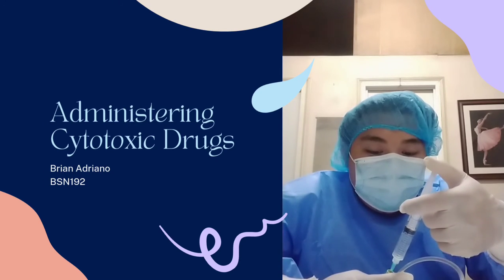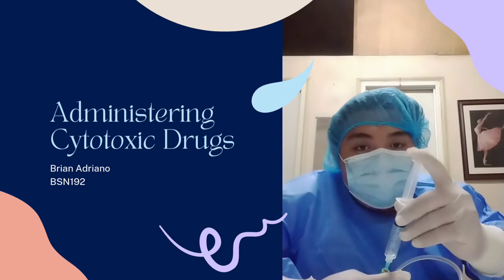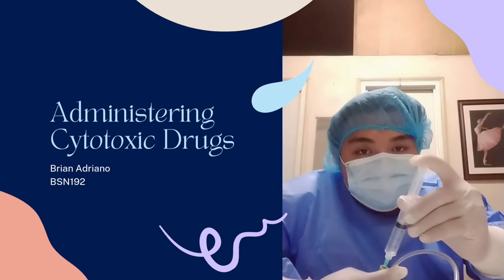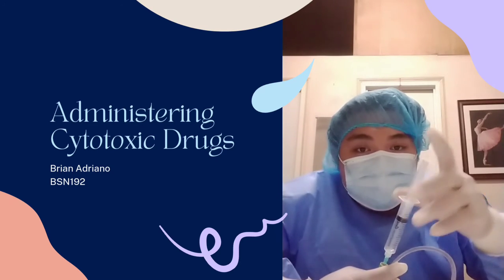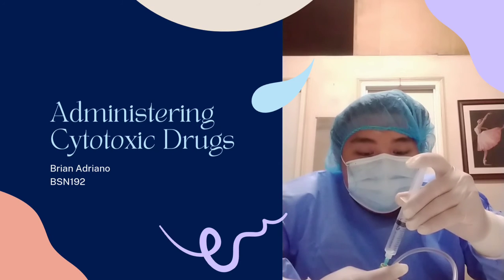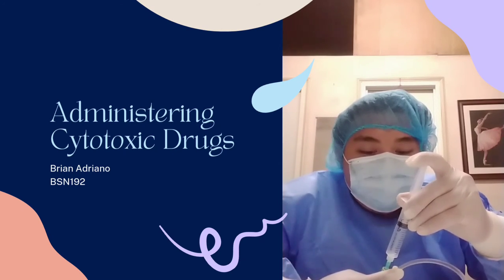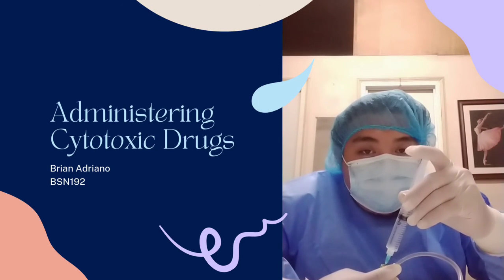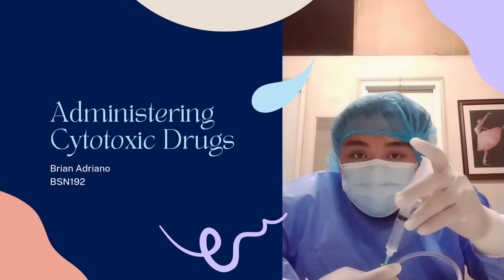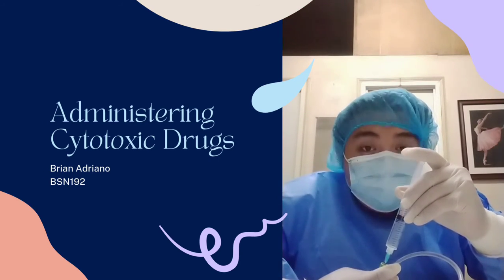Now, if there is a blockage, or you cannot push the syringe easily, there you must assess the IV line. But if the IV line is out of line, or there is a bulge in the IV.